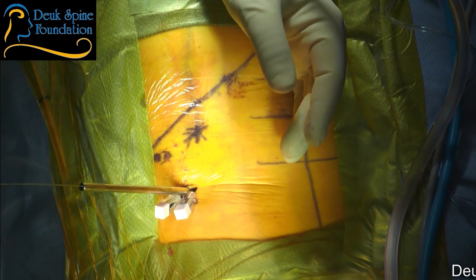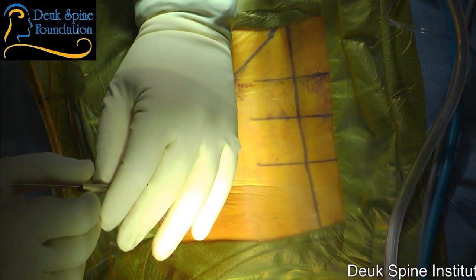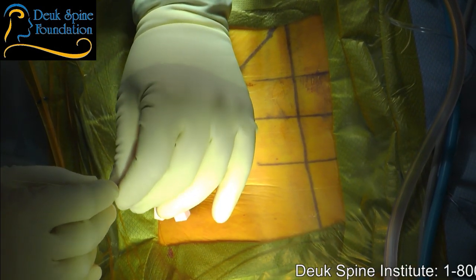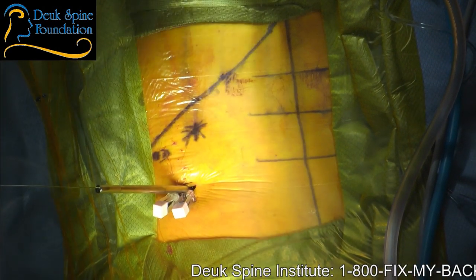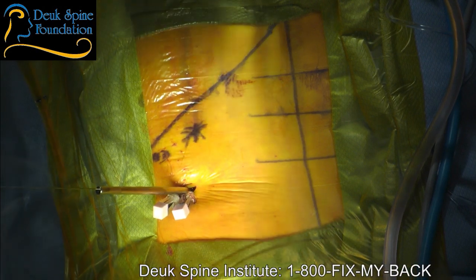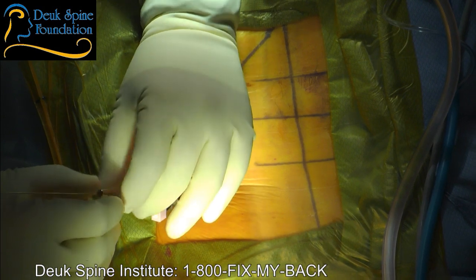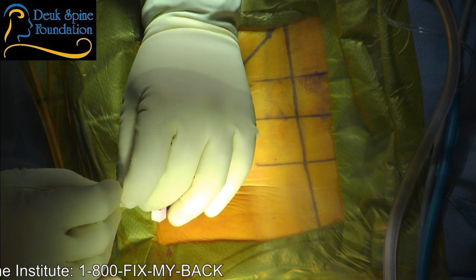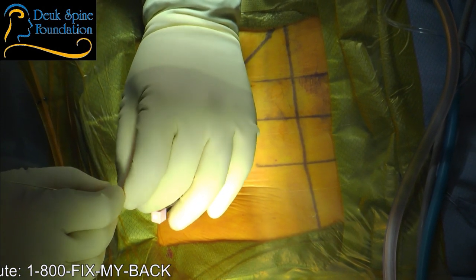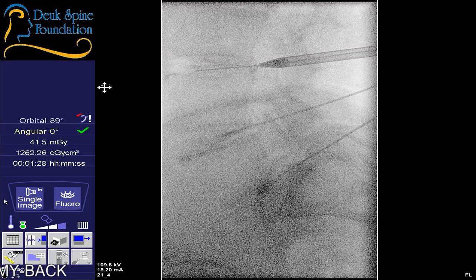Okay, is he ready? Should I proceed or wait? All right, so we're advancing the dilator along the guide wire. You want to make sure the guide wire doesn't move into the abdomen or pelvis. So you can see it's staying right where it's supposed to be. You can actually see the herniation in front of the dilator, that lump. That's the dye going into the herniation and kind of outlining it, in the foramen. That's right where his nerve is being pinched. Now you can see the tip of the dilator is up against the herniation.